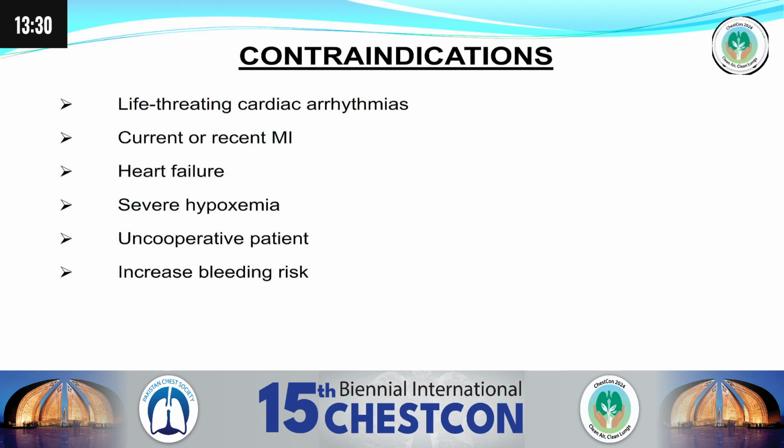Contraindications are simple: the patient should not have any cardiac arrhythmias, recent or current MI, heart failure, or severe hypoxemia, and should not be uncooperative. And we should rule out blood dyscrasias before starting the procedure. We should have his recent PTTK.